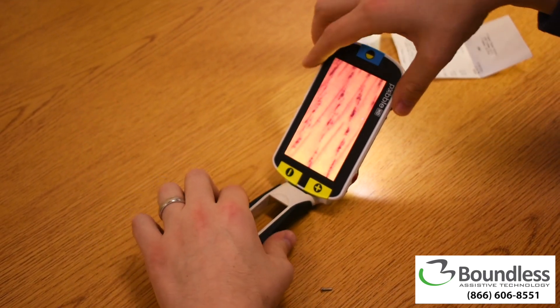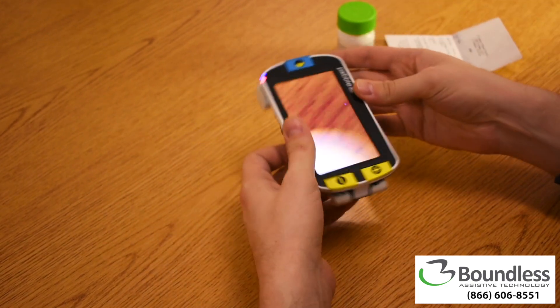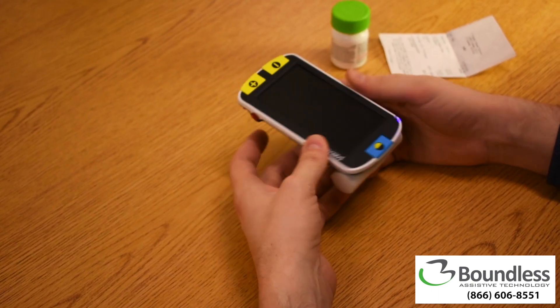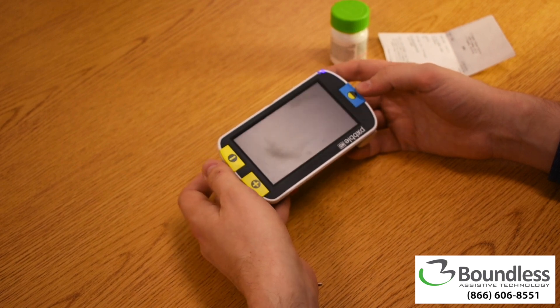With so many options, it's easy to see why the Pebble HD is one of our most popular handheld magnifiers. If you would like to discuss the Pebble HD, just give us a call today at 866-606-8551.